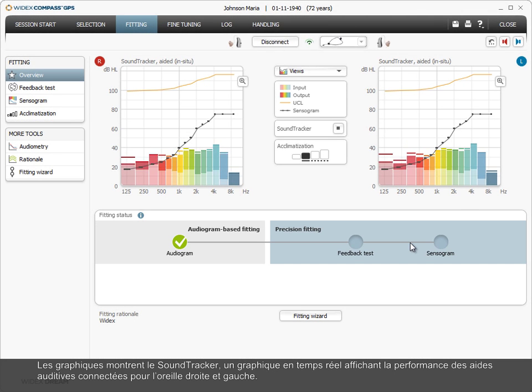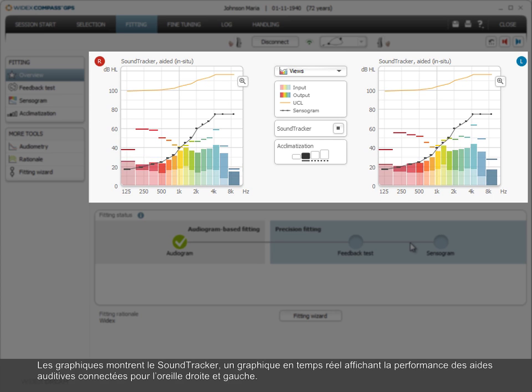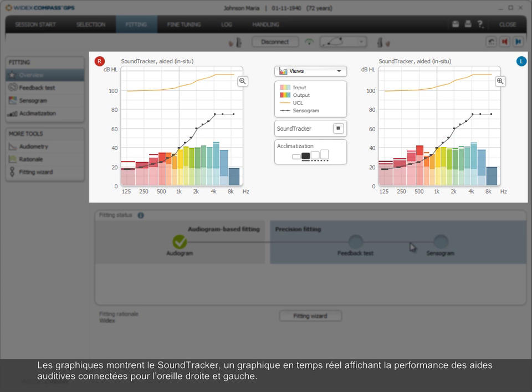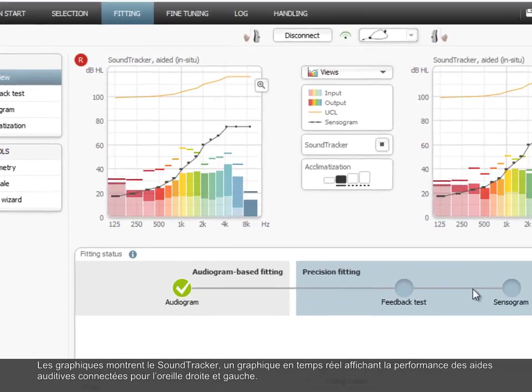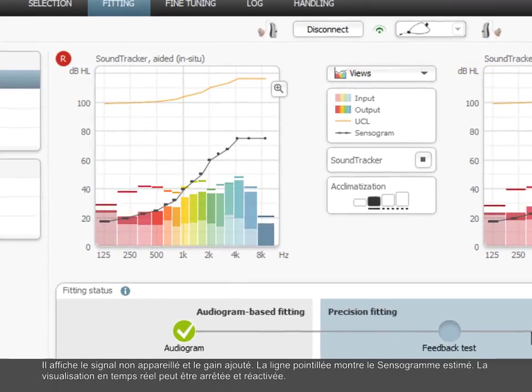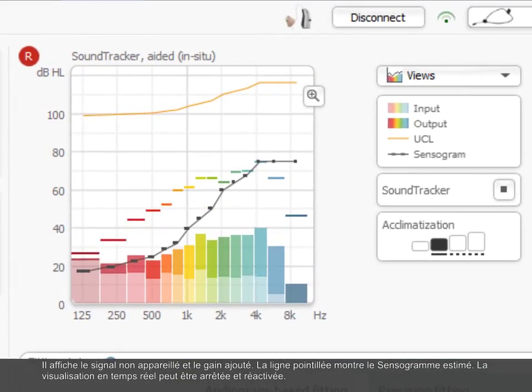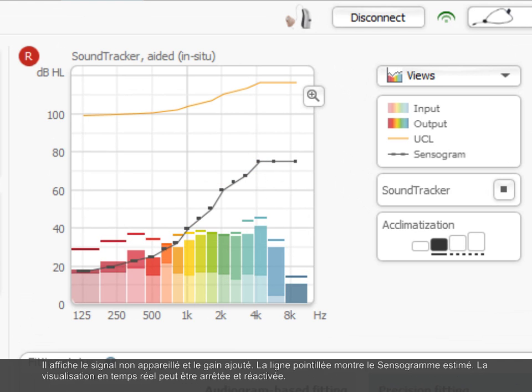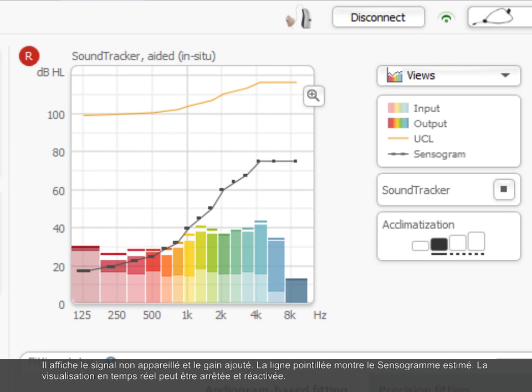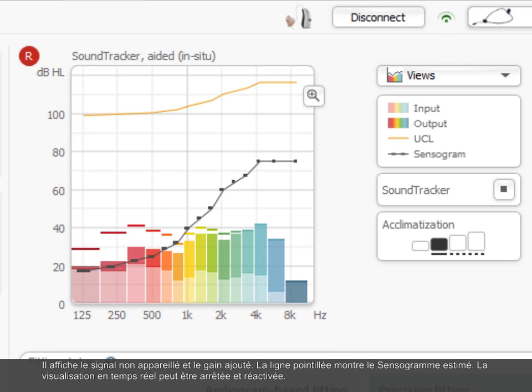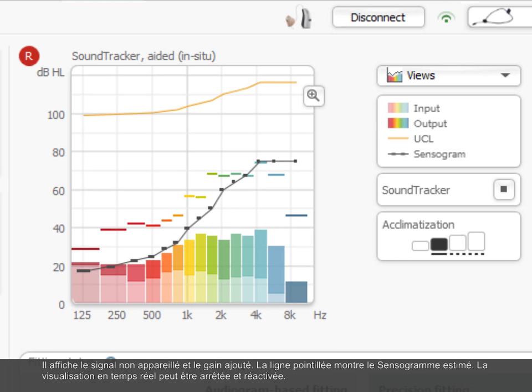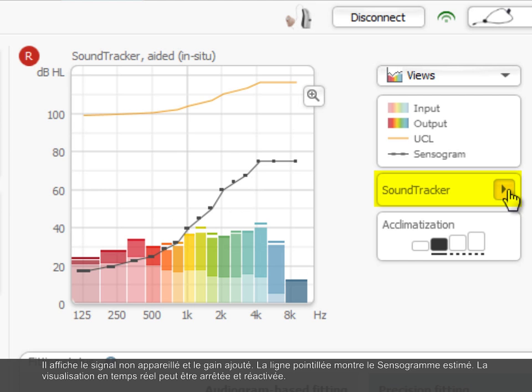The graphics show the sound tracker, which is a real-time graph displaying the performance of the connected hearing aids for the right and left ear. It shows the unaided signal and the gain added. The dotted line shows the estimated sensogram. The real-time visualization can be stopped and reactivated.